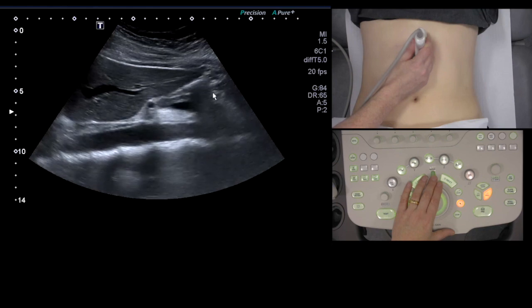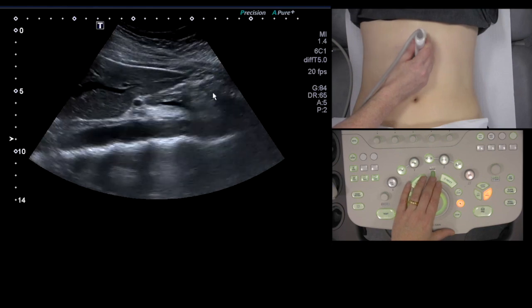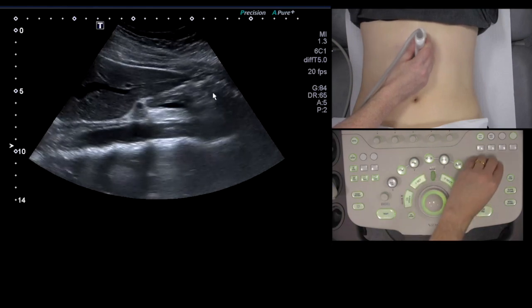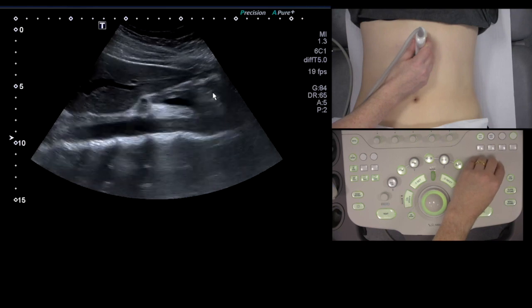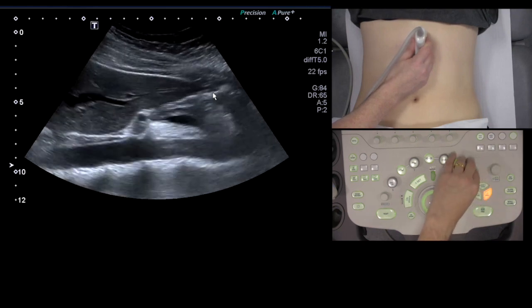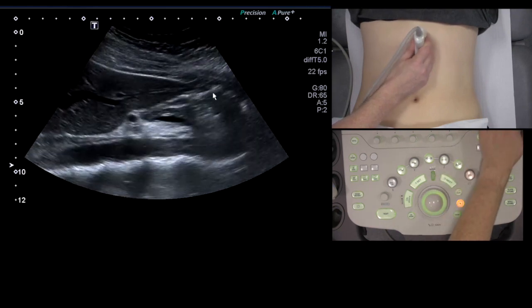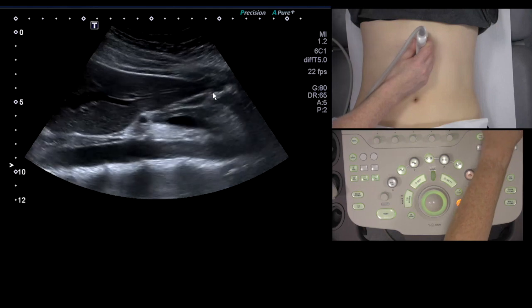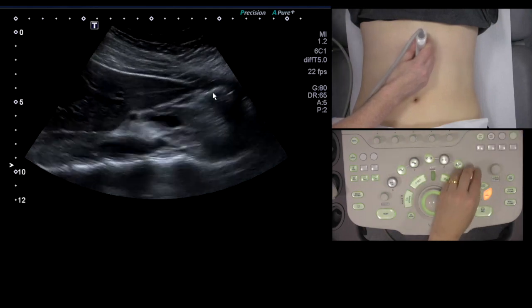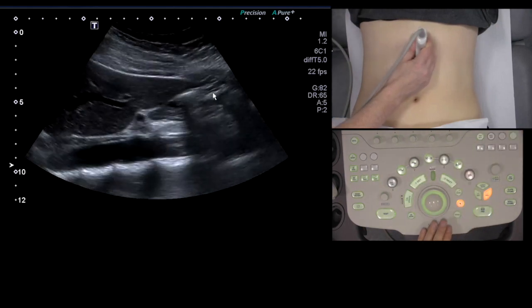The good thing about starting in lung section is it allows you to optimise your settings. As you can see, you're putting your focus in the right place, optimising your depth, and making sure that your gain and your time gain compensation are actually set correctly.